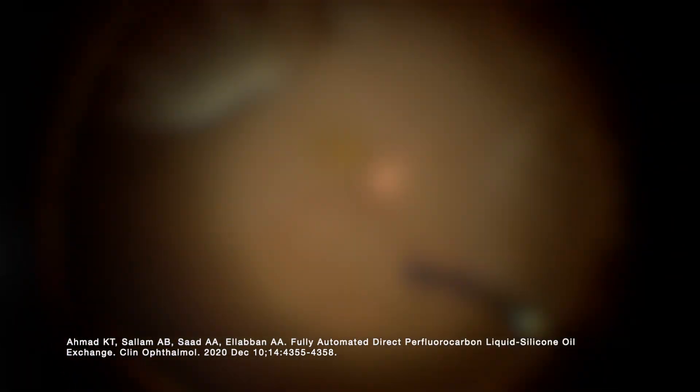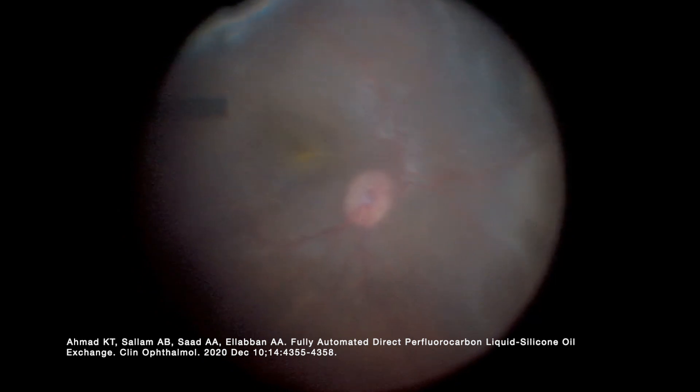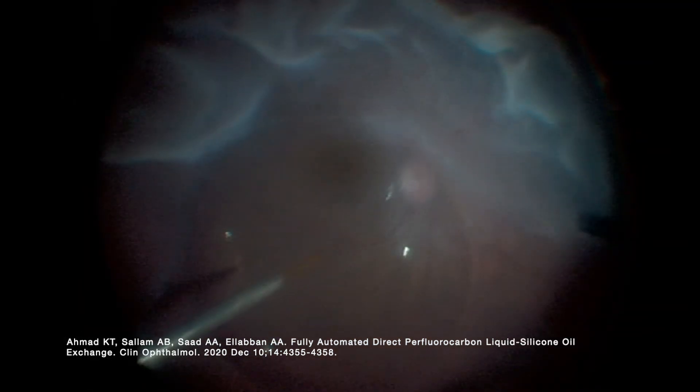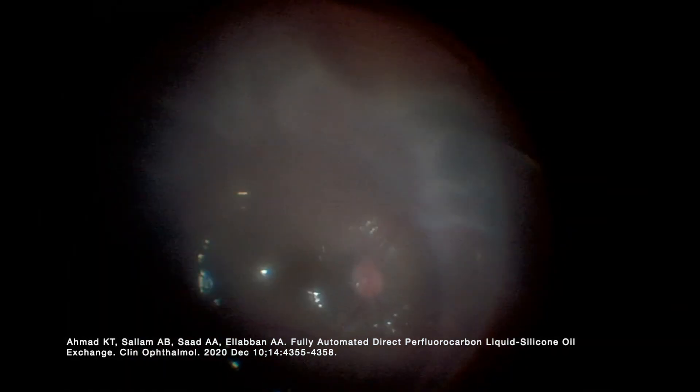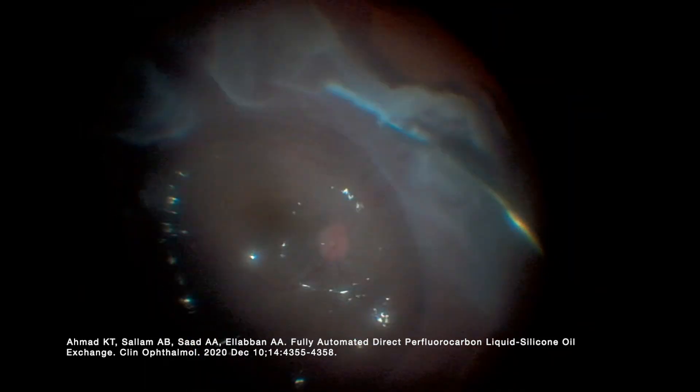This is the first case of 25 gauge vitrectomy for a giant retinal tear with PVR. We stained with blue dye but we didn't see any significant ERM to peel. Probably immature membranes anteriorly, not much to peel.